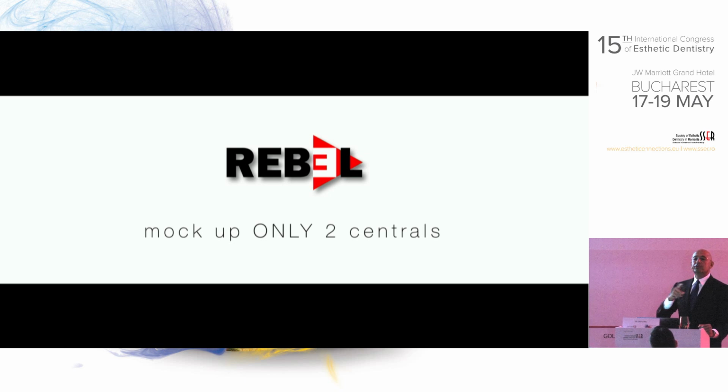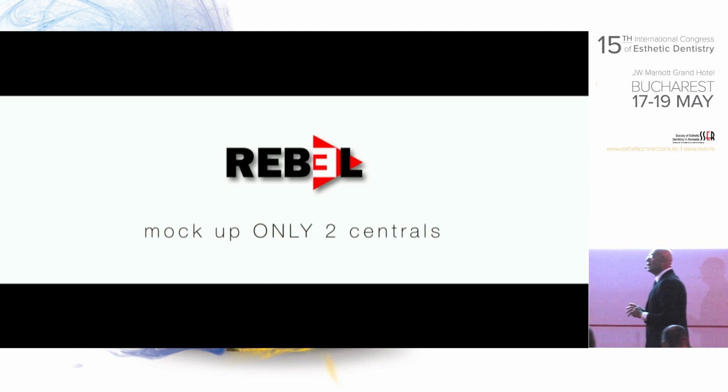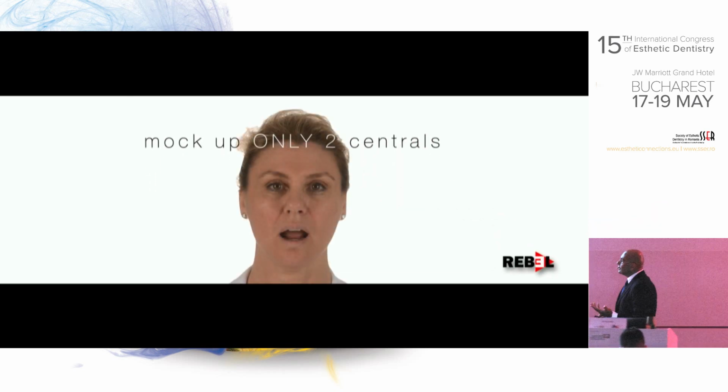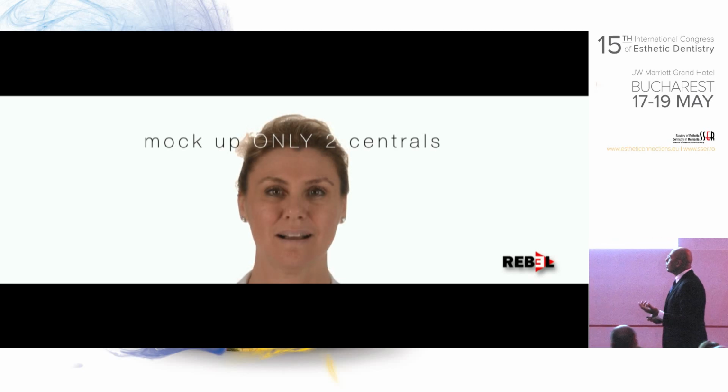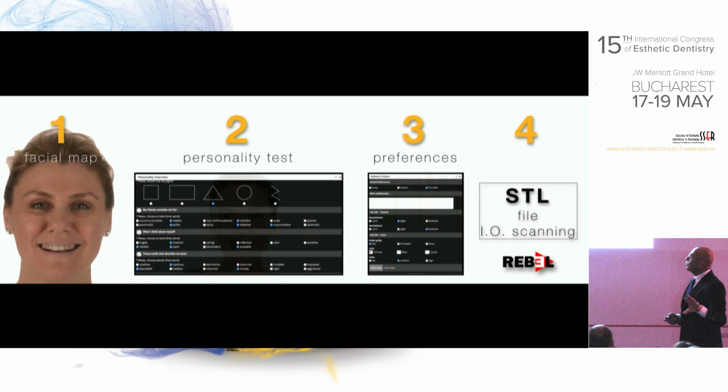Tell you the truth, you never have to make the best design. The reason why we do one or two mock-ups on the centrals is to exactly define the incisal edge position, because the rest will be done by the software, but we have to be precise on the incisal edge position. So this is what I did. I'm doing these mock-ups, smiling, whatever, and I'll show you a very, very simple photography protocol.